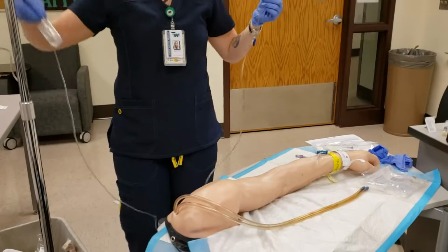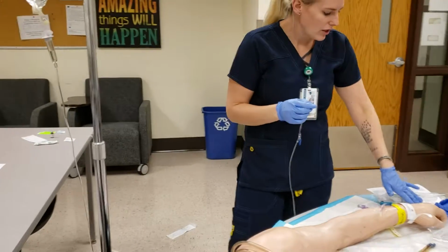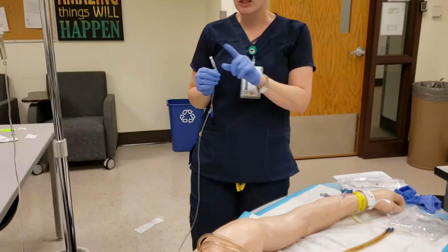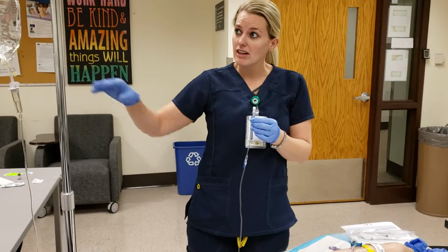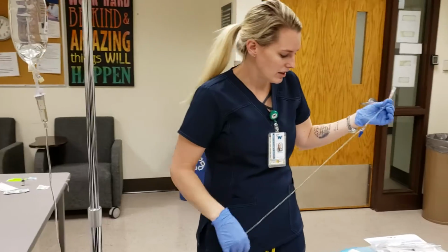So I would insert this into my pump and I would program my pump. I've already done my math, so he wants it at 200 milliliters per hour, so I would put 200 milliliters per hour for the rate, and then for the volume to be infused, we would do 975 so that we have some time to get a new bag and hang it before it runs out.